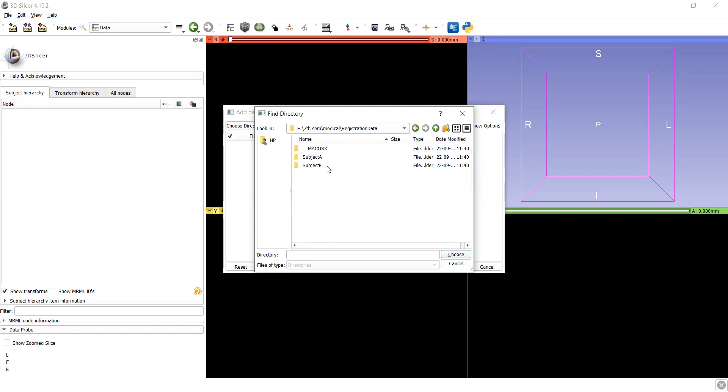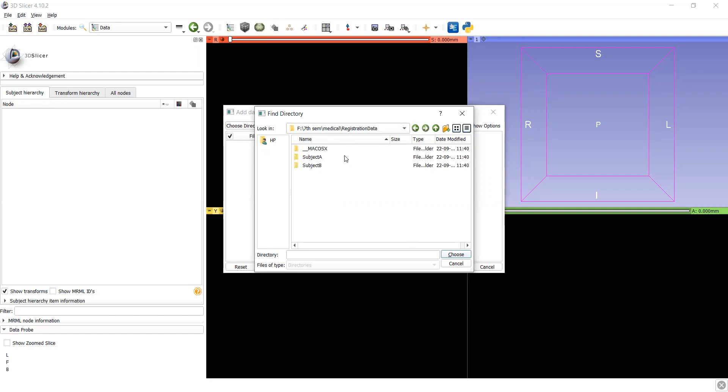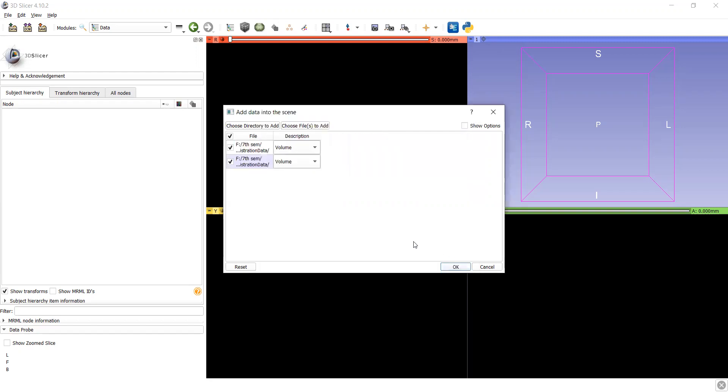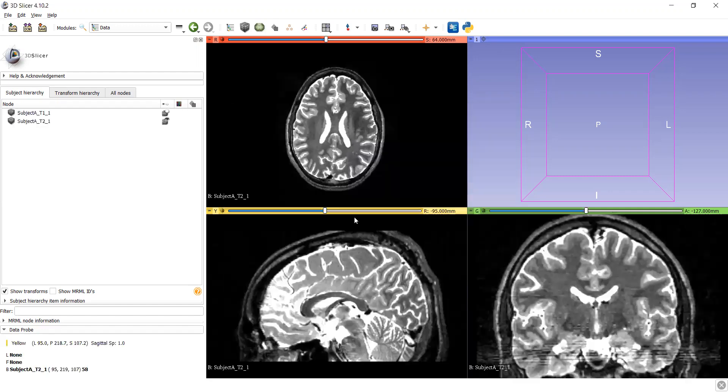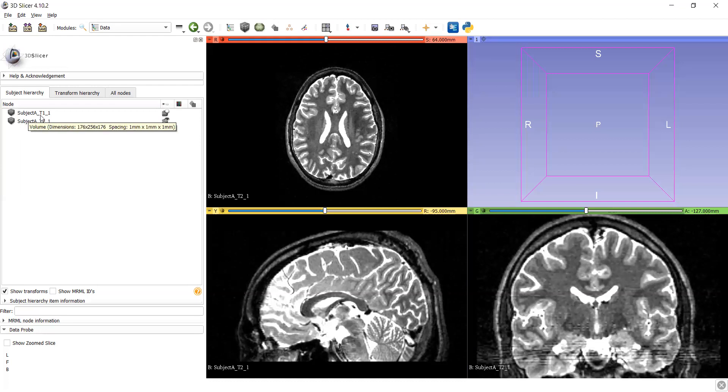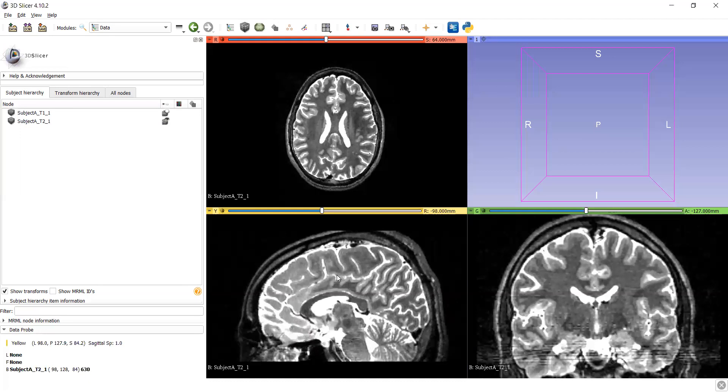One is subject A, subject B. Both are two different images and I am picking one images. In this subject A will have two volumes. Let's choose that and you will see here a subject A T1, T2.